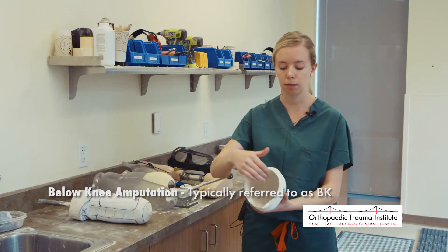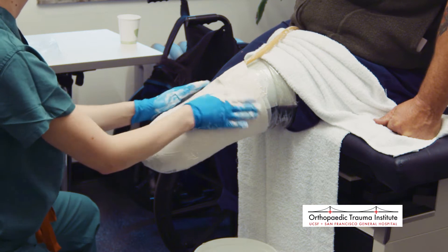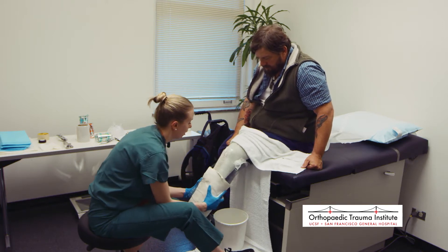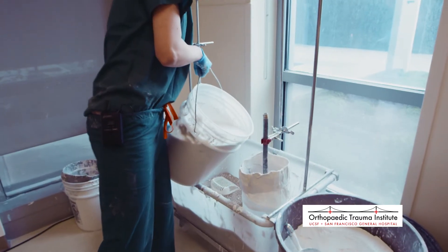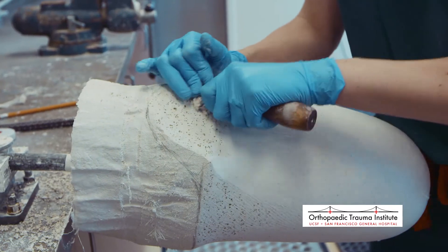The cast is hollow inside — it's just a copy of the limb, and it will be very customized based on where we can place pressure and where we can't. We're never trying to put pressure on the bottom or weight-bearing area of a cut bone, so we always try to make that comfortable. Once we have the cast, we fill it with plaster to get a positive model — an exact copy of your leg at the time of casting, though sometimes we change it to increase or reduce pressure in certain areas.